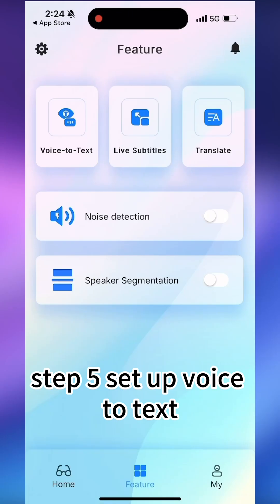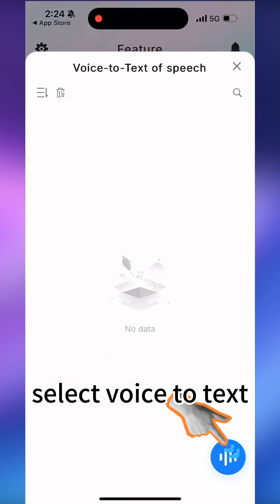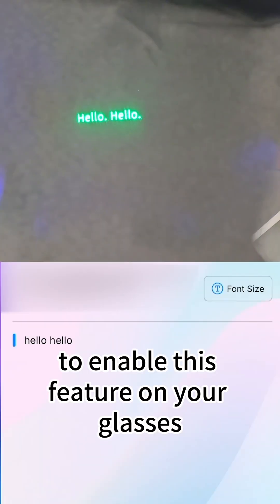Step 5: Set up voice to text. Open the HearView app and tap Features. Select voice to text to enable this feature on your glasses.